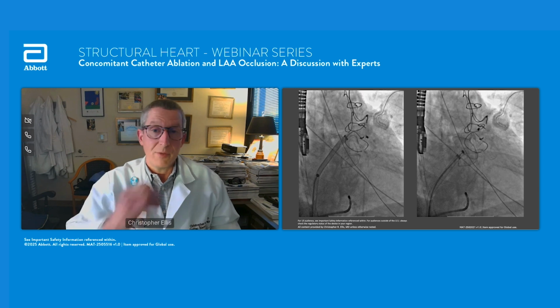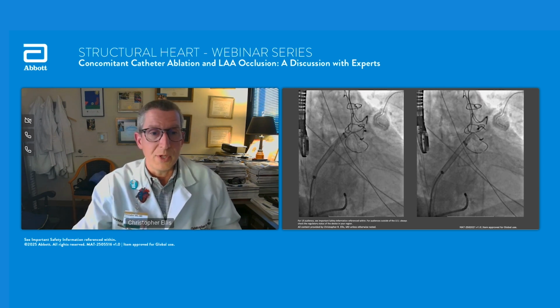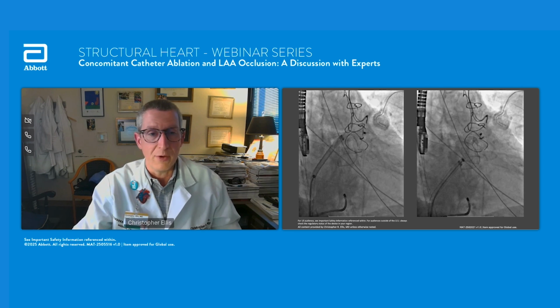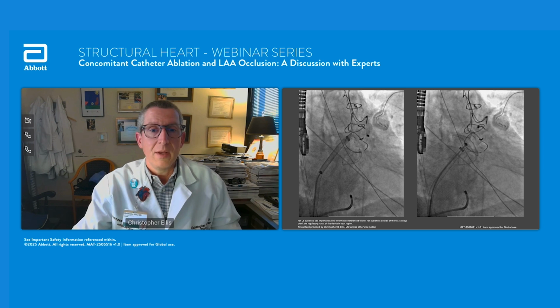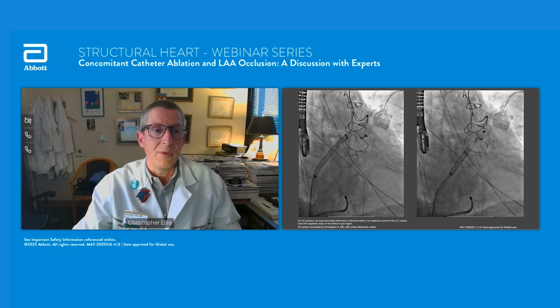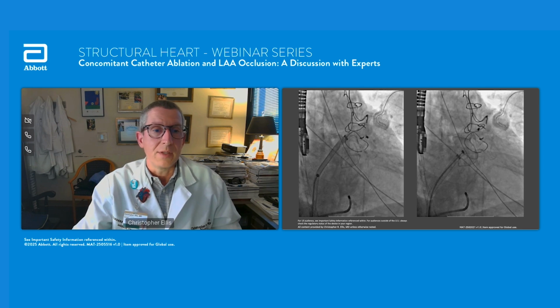So the transition from the sheath to, I think it's a lot of large bore sheaths. You want to be very mindful of air embolism, ACT over 300 consistently. Really make sure you heparinize once you get access and get wires in, so you don't start the clot propagation cascade in any way on these cases.